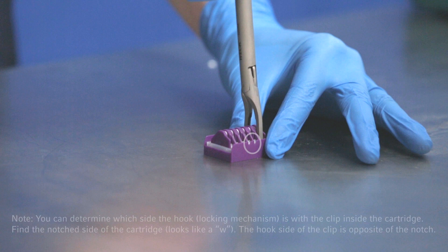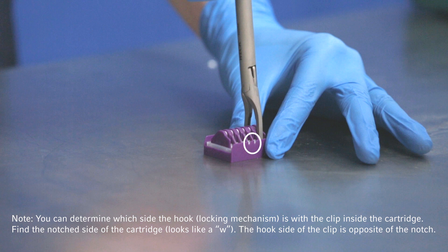Do not force the applier into the cartridge or onto the clip. The applier should enter and withdraw from the cartridge easily.